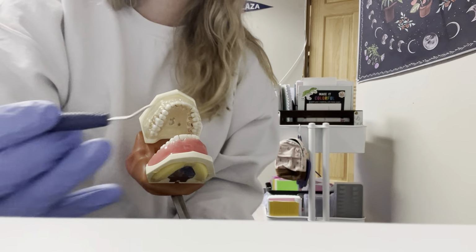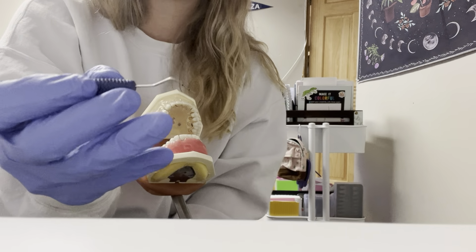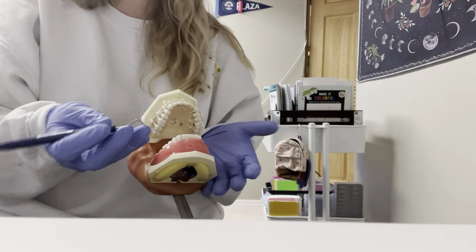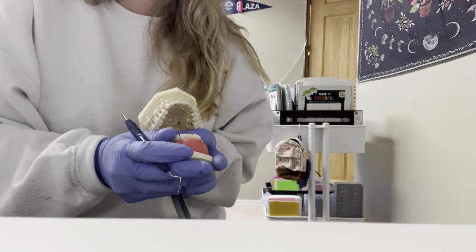So how we hold the probe is we're going to use a modified pen grasp, and we're always going to hold the probe with light pressure. You never want to dig deep down, because you'll be able to hurt the patient. You never want that. So why do we probe?